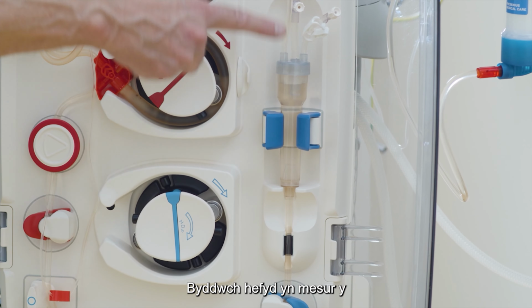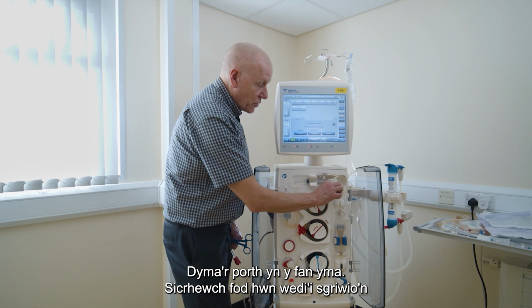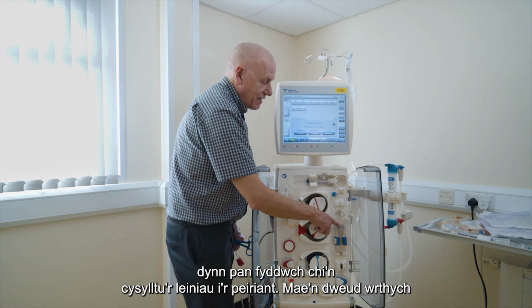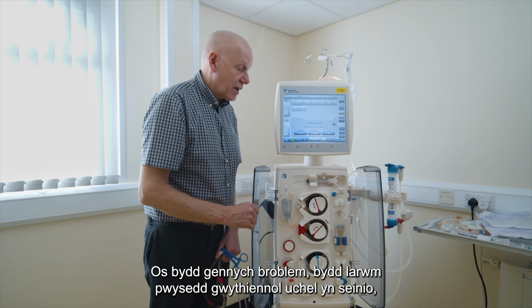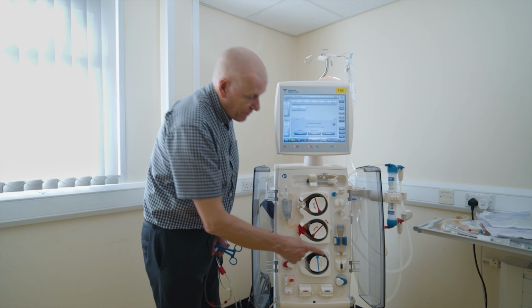On that chamber as well, you also measure the venous pressure. That's that port there. Ensure that that is screwed on nice and tightly when you line the machine. That tells you how good your access is going back into your fistula. If you have a problem there, you will get a high venous pressure alarm. Or if the blood should start clotting, you will also get a high venous pressure alarm.